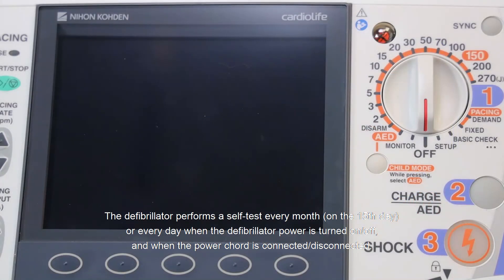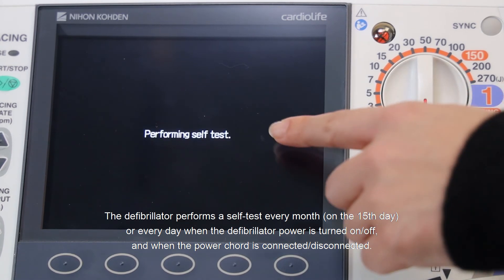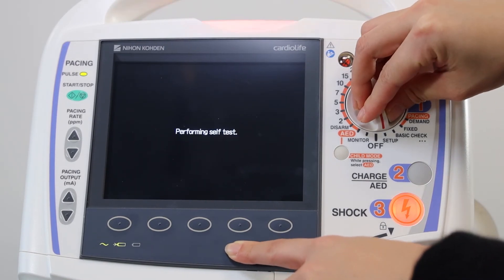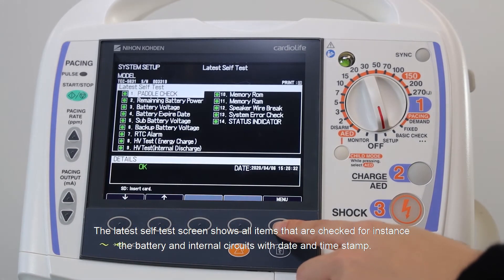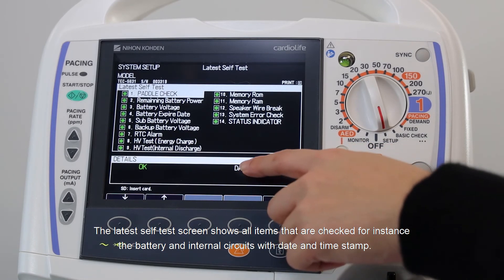The defibrillator performs a self-test every month on the 15th day, or every day when the defibrillator power is turned on or off, and when the power cord is connected or disconnected. The latest self-test screen shows all items that are checked, for instance the battery and internal circuits, with date and time stamp.